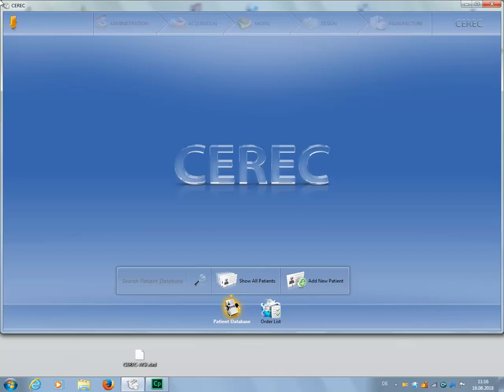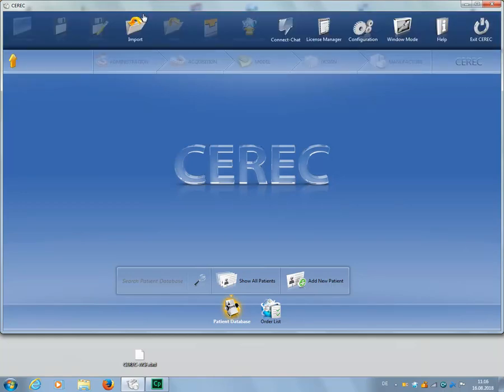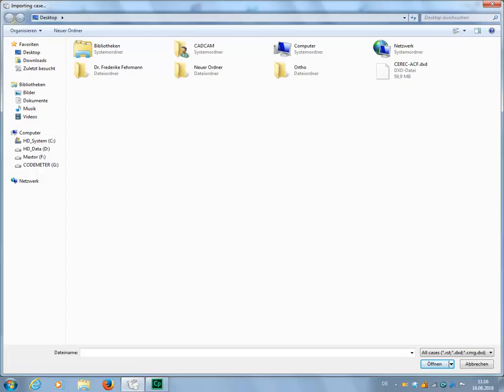There are two ways to import. We move the cursor to the upper edge of the screen of the CEREC user interface so that the system menu will open and click Import. The CEREC software will take you directly to your drives. Select the respective storage location and .dxd file, then click Open.